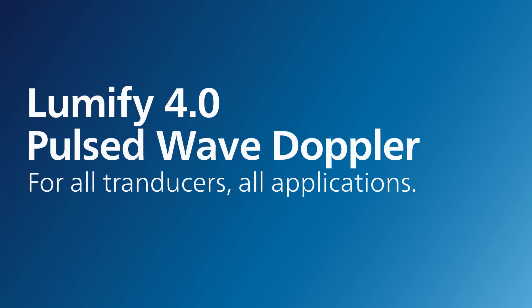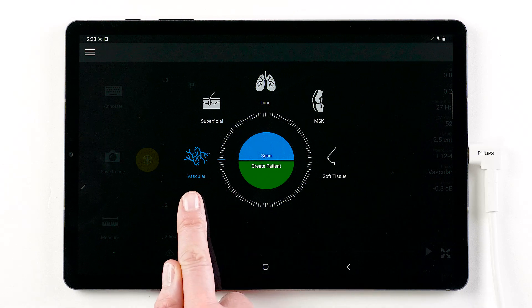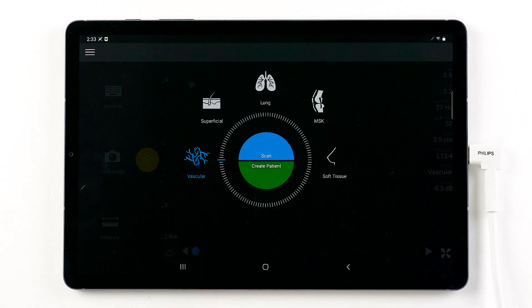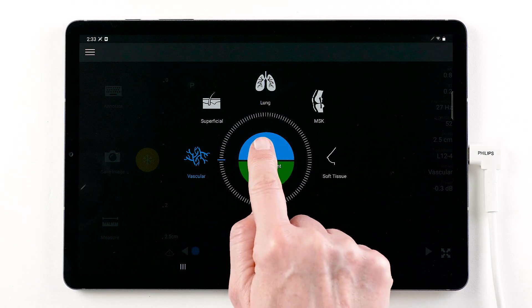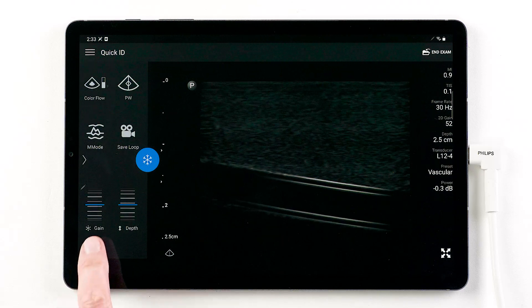Lumify 4.0 introduces pulsed wave Doppler for all transducers, all applications. For this demonstration, we will be using the linear transducer with the vascular preset. From the 2D image, adjust gain and or depth as needed.